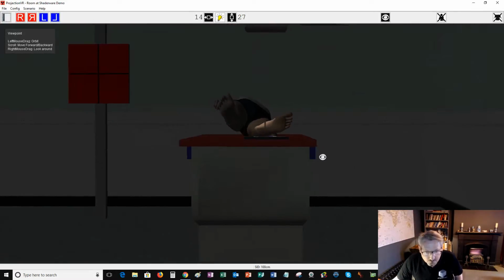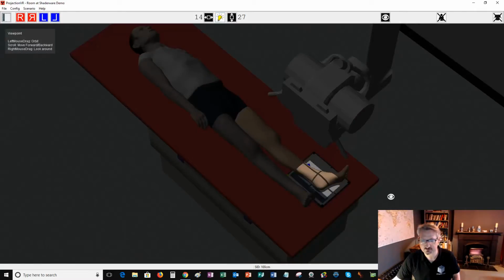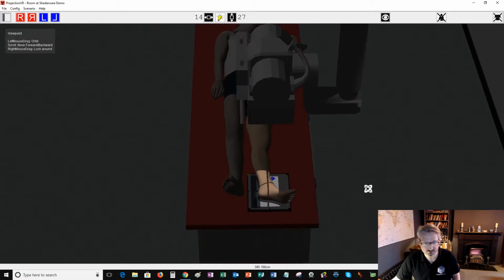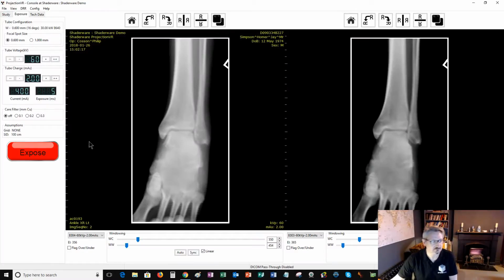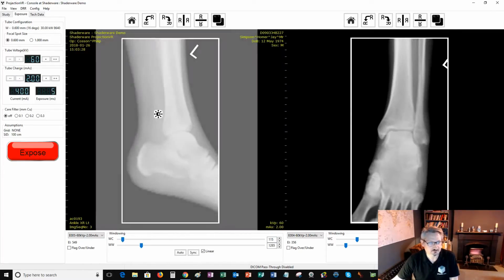Okay, so it's just a mouse. Just make sure you're looking at it from different angles, just like in real radiography, really. If you just stand there and don't actually look around, every radiographer's got that little head movement, haven't they, that makes them look and see what's going on. So I'm now happy to complete that. And we've got the lateral.